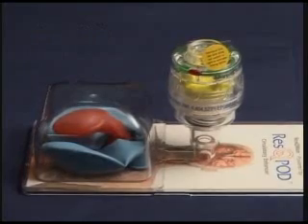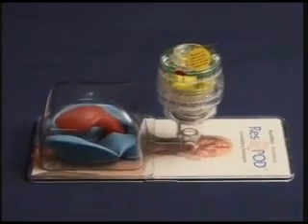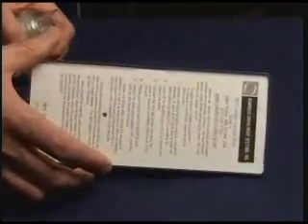If you're going to use the Rescue Man demonstrator to show others how CPR works, remember to follow the instructions on the back. It's important to prime this device before using it, and the instructions are pretty clear-cut.